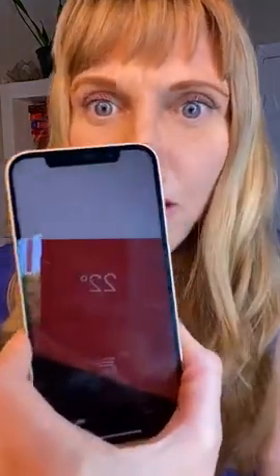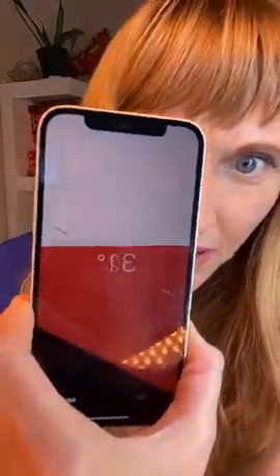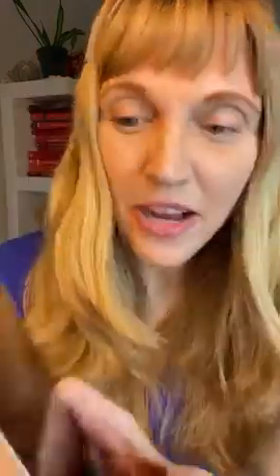Hopefully they're at about zero degrees. That means their perception of vertical is aligned with true vertical. If it's not — if it's greater than a degree from neutral — then we know that their subjective visual vertical is skewed. Typically we want to see this within a few degrees, usually within one degree of neutral.